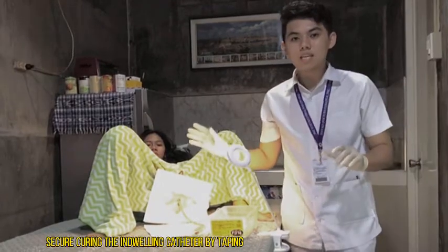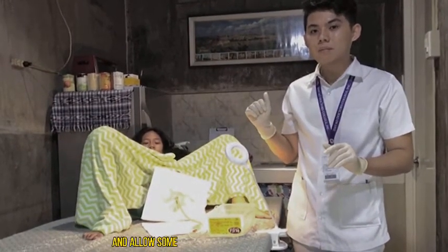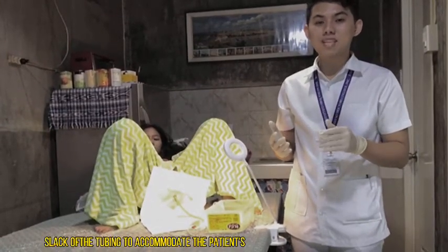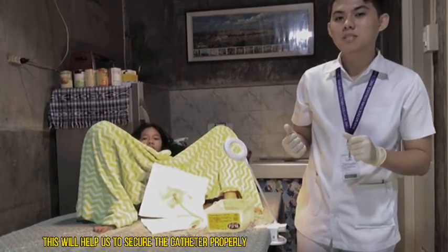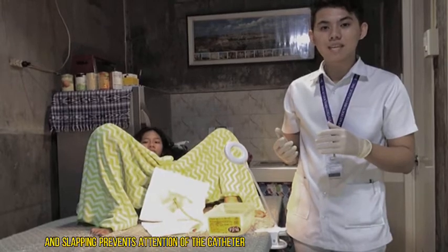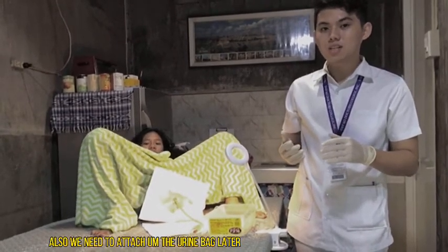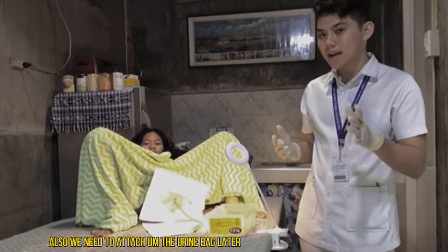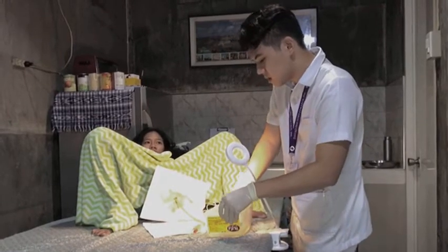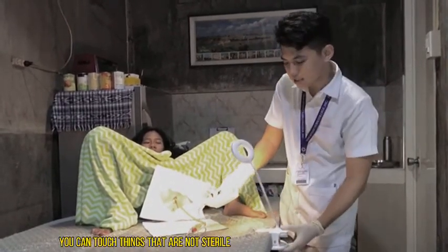So now we will be securing the indwelling catheter by taping it to the patient's thigh and allow some slack of the tubing to accommodate the patient's movements. This will help us to secure the catheter properly, and slacking prevents tension of the catheter when the patient moves. Also, we need to attach the urine bag later. So since we are not sterile anymore, you can touch things that are not sterile.